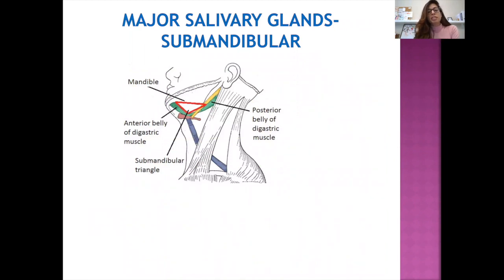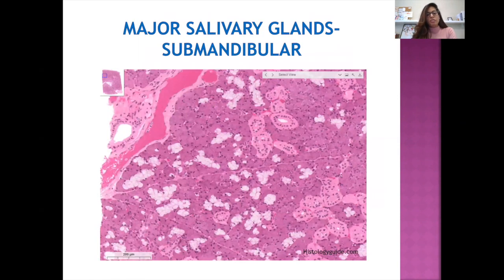Moving on to the submandibular gland, in terms of anatomy it's located in the submandibular triangle, right under the angle of the mandible, bounded anteriorly by the anterior belly of digastric and posteriorly by the posterior belly. The most characteristic finding of the submandibular gland is serous demilunes — caps of serous acini over mucus acini. The rest of the ductal morphology remains the same in all major salivary glands.